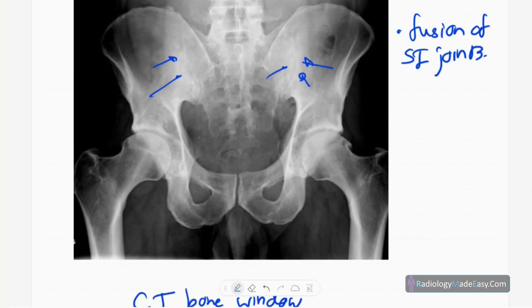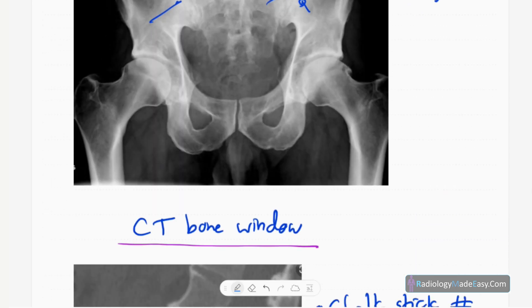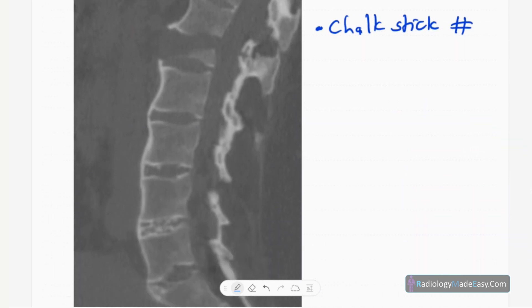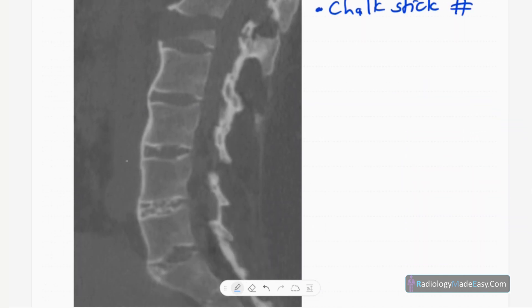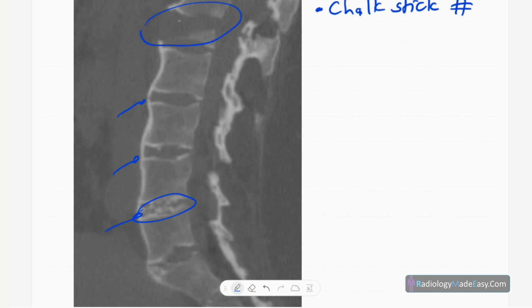Another example of ankylosing spondylitis on CT bone window shows syndesmophyte formation and ossification of the anterior longitudinal ligament. You can also see ossification of the intervertebral disc and a fracture of the vertebral body — called a chalk stick fracture.